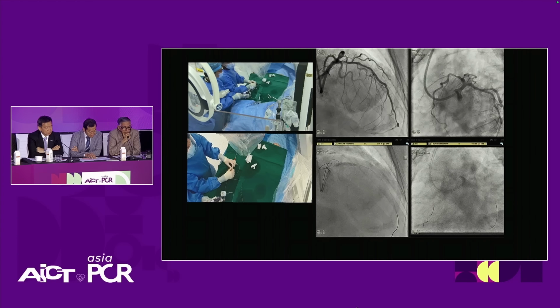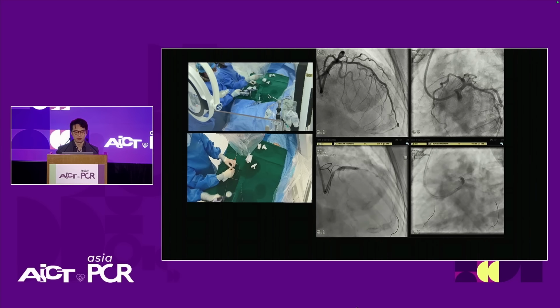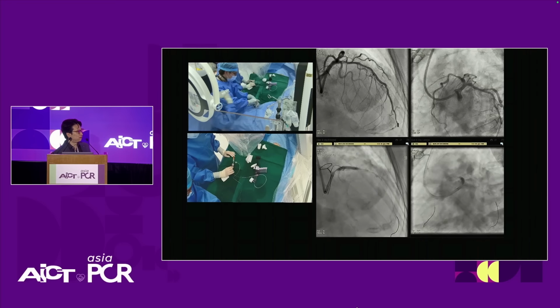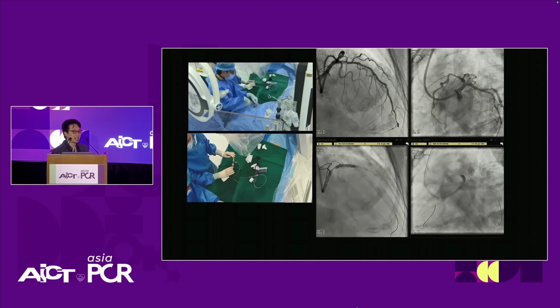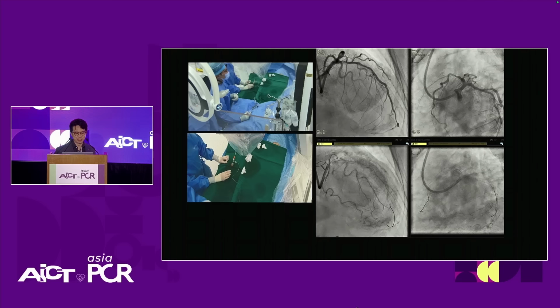That's what we did. We had initial lesion prep with the 1.75 rotabur. Essentially, that helped modify the superficial calcium and superficial aspects of the plaque. With a cutting balloon, of course, you get deeper expansion and you get into the tunica media. And the rota before the cutting balloon does make the procedure more predictable, with less chance of uncontrolled dissection during cutting balloon inflation, which is what Hui Wen did very well. She did the entire procedure. I was just wiping wires for her and injecting contrast, basically.